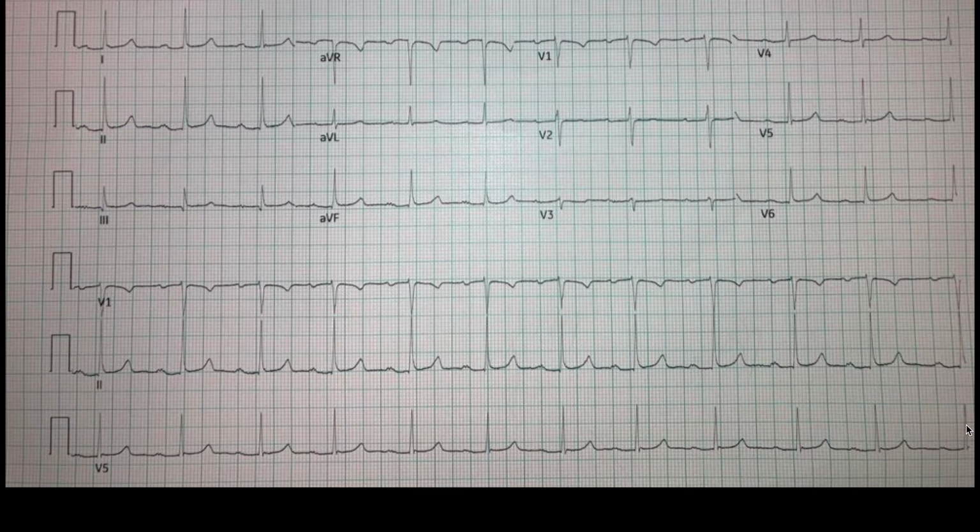1, 2, 3, 4, 5, 6, 7, 8, 9, 10, 11, 12. We just about got 12 in there. So it's a 10 second strip, and there are six of those in a minute. So 12 times six gives us 72, and we're just a little short of that. So let's say a rate of around 70. That's pretty close, so let's call this essentially a normal rate, but we'll call it 72.